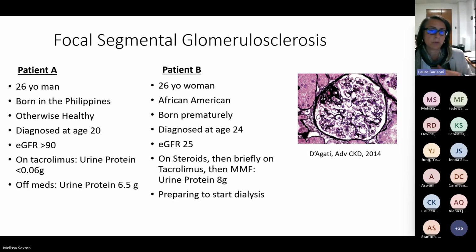One is a man, one is a woman, different race, different clinical history, and different outcome. One is going on dialysis, the other one is responding to therapy. So the idea is that if we have a permanent library of images, we can do more than conventional diagnosis, and we can explore different methodology and interrogate the tissue so that we can extract information that was not available to us before. Next one.